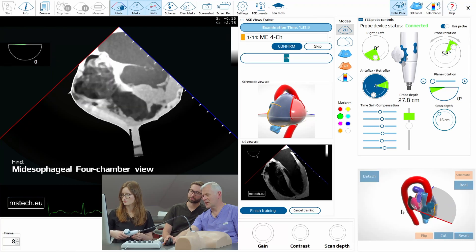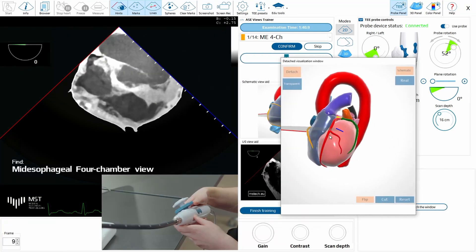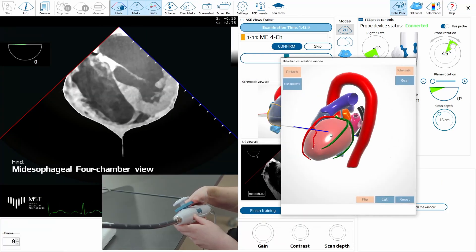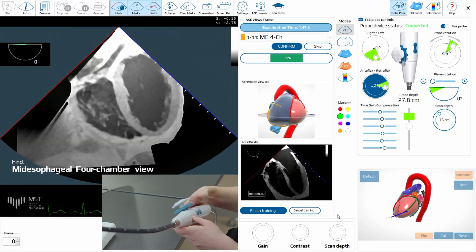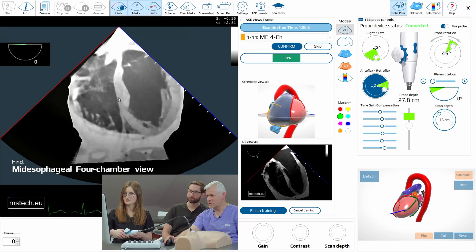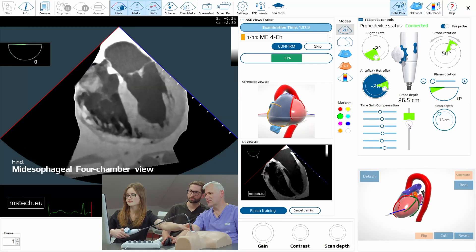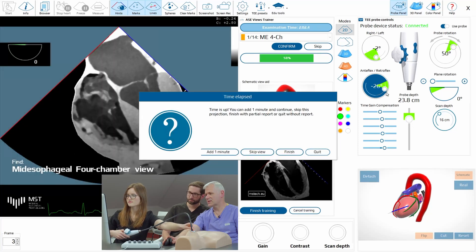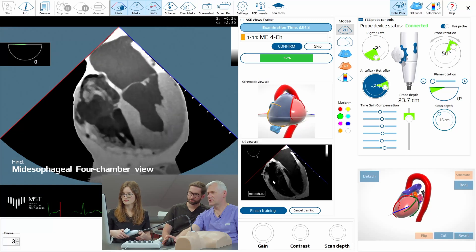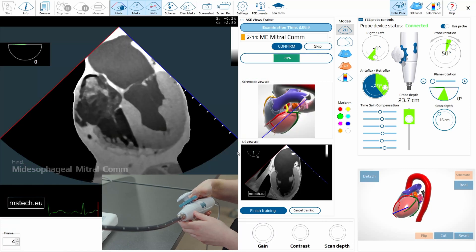I will just make it easier for you. What you have to do is to change a little bit the orientation of the probe. Yes — very good. And keep it, and probably you have to pull it a little bit higher, as it's shown here, to have really the four-chamber view. Slightly higher, a little bit more retroflex. Very good. Keep it, keep it. You see — four chamber, four chamber. This is what was to be done.